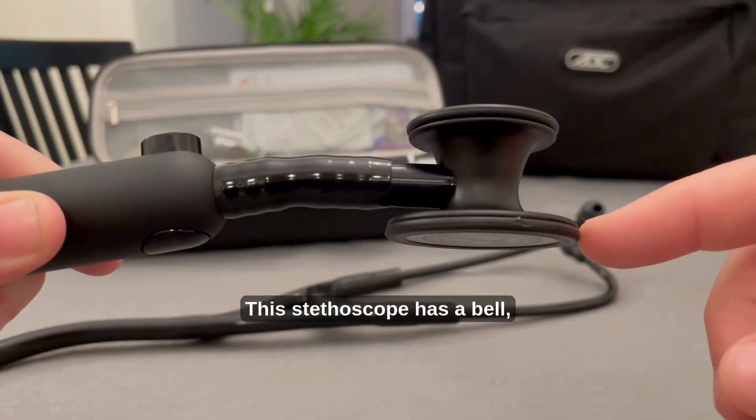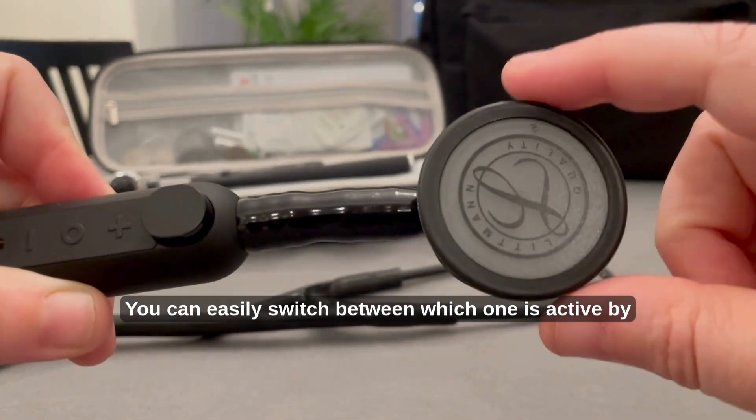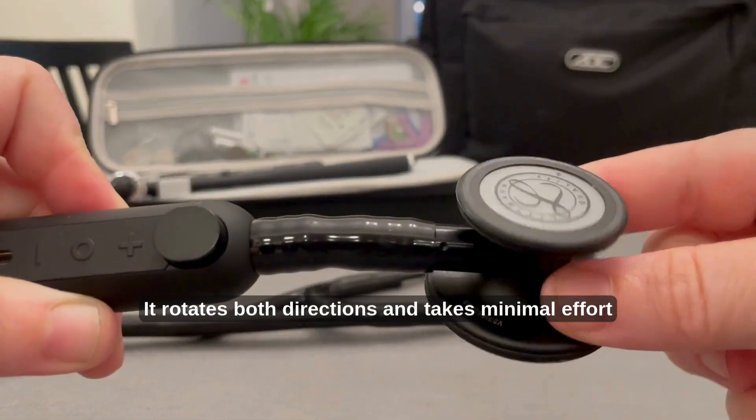This stethoscope has a bell, the smaller piece, and a diaphragm, the larger piece. You can easily switch between which one is active by rotating the chest piece until it clicks. It rotates both directions and takes minimal effort to switch.